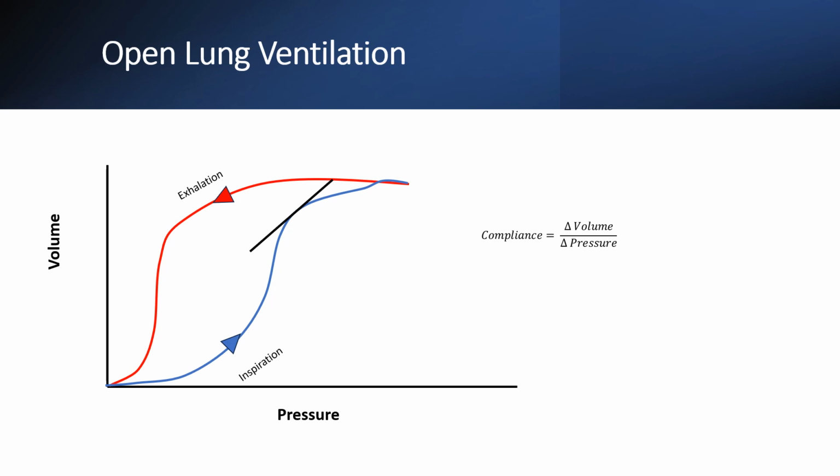It is also important to notice that after the alveoli are opened, it requires less pressure to maintain them in the open position. If a line is placed at a pressure of 8, the inspiratory or opening side of the curve is just beginning to open and fill. After it has been filled with air, the same pressure maintains a great deal more volume. Preventing the collapse or inhibiting the elastic recoil to a slight degree will maintain the alveoli in the open position with an optimizing mean airway pressure.